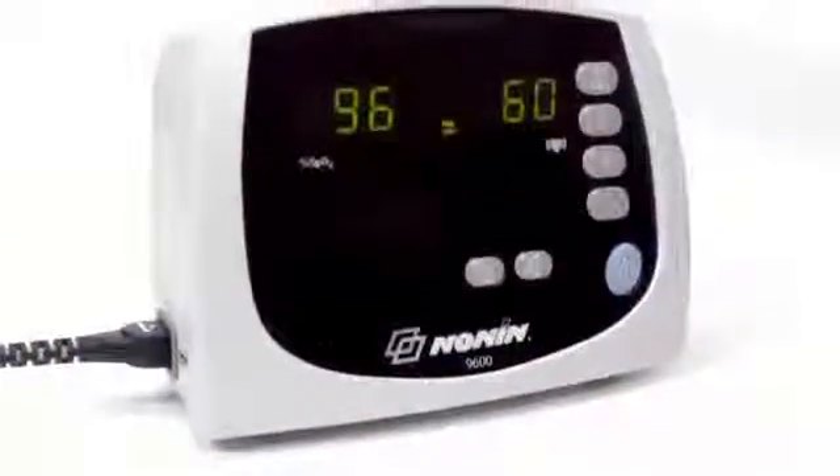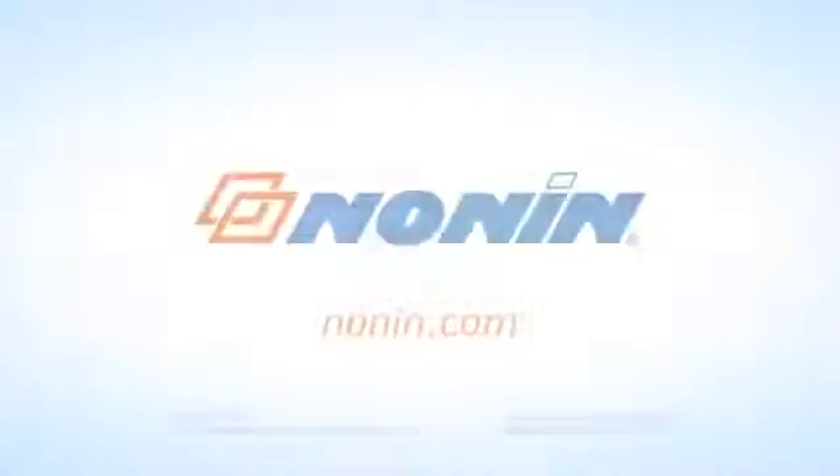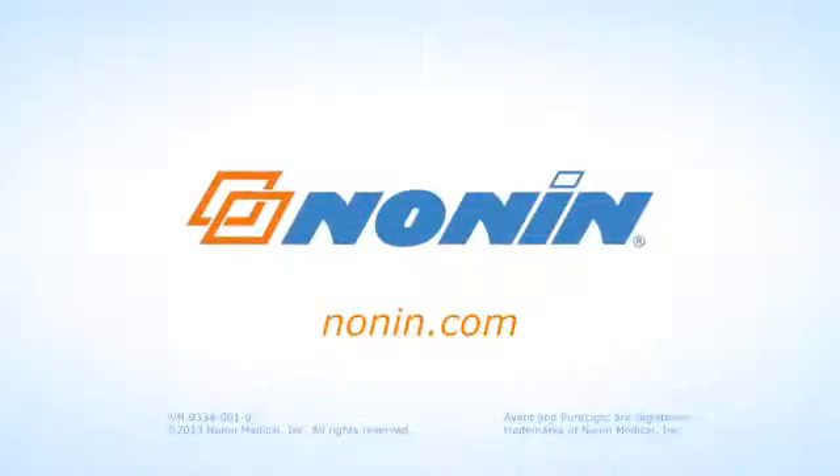With proper use, the Nonin Avant 9600 pulse oximeter will provide consistent, accurate oxygen and pulse rate measurement. You can find additional use information on this and other Nonin products at www.nonin.com.